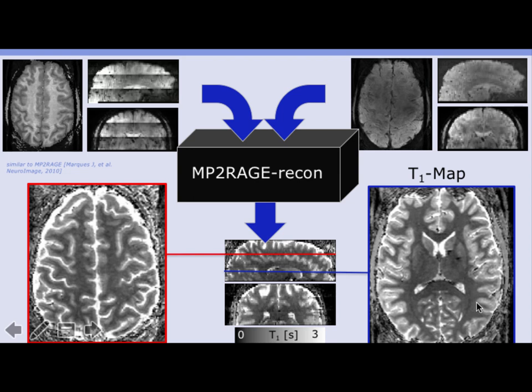And I believe that here you can nicely see the contrast-to-noise ratio between gray matter and white matter, or gray matter and CSF. That is enough to get a good segmentation and layering as well.